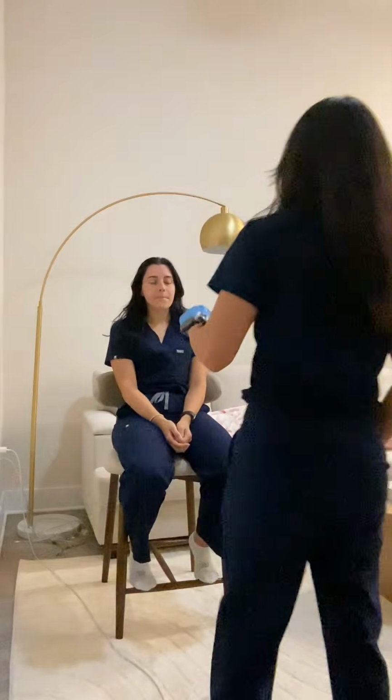All right. Now I'll begin the oral examination using a pen light. I'm going to put on my gloves now. I'm going to use gauze and a tongue depressor as well. Okay.